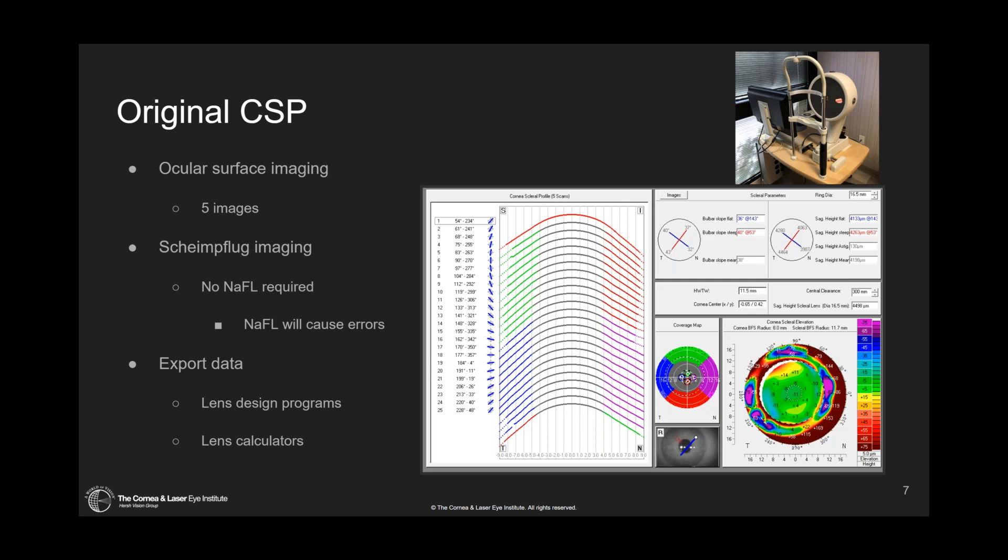The original CSP works by taking five different image sets: one centrally on the cornea, one on the nasal side, the temporal side, the superior and the inferior, to get that corneal and scleral shape. This gives us essentially a three-dimensional mapping of the scleral shape — almost like a corneal topographer but all the way out onto the sclera.